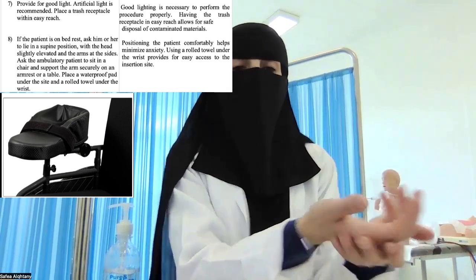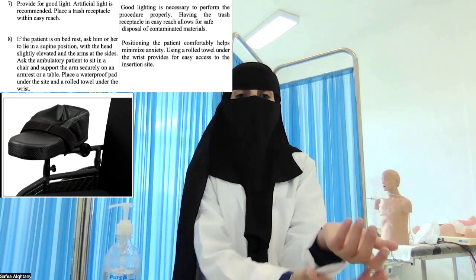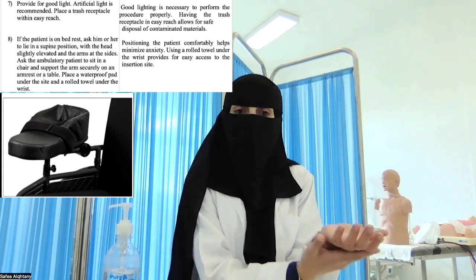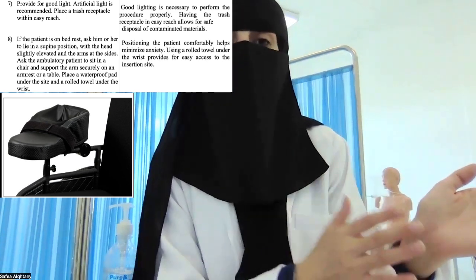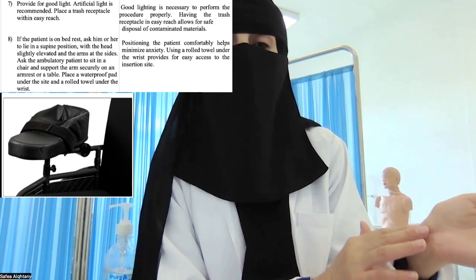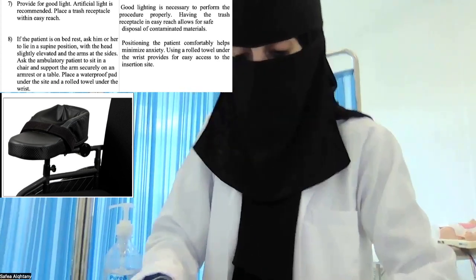يعني لما يكون الشخص جالس بالعادة تكون الأيادي أحيانا مدلدلة على الأرض. So I need to support his hand like this in order to expose or promote. This will give us a better access to the insertion site. Then I need to test for the adequacy of blood circulation in the extremity that I will be used in order to obtain the sample.